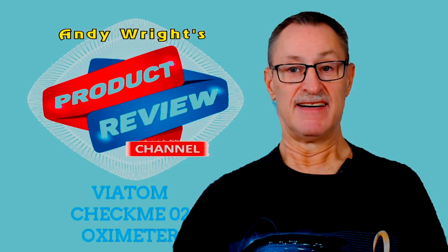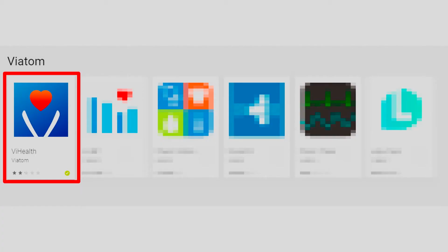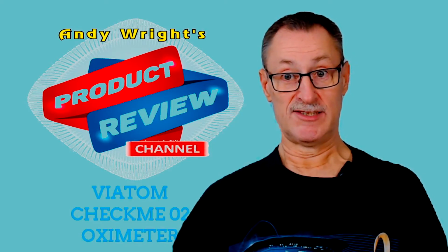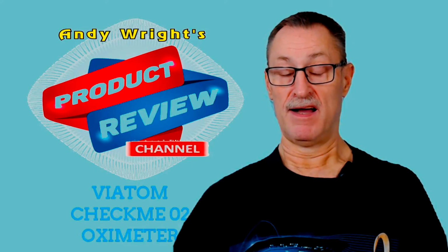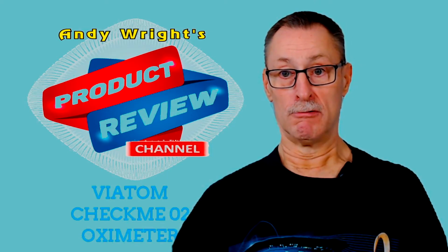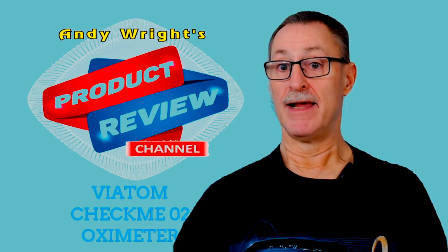Lastly, the app. Downloading the app. Yes, that was a right palaver. Now, make sure that you actually read the book, because it does say VI Health. I put in there V Health, and of course it came up with a whole load of apps which weren't right. So VI Health is mobile, is the app name. It does come up. It's a little blue icon on the Play Store. It works on Apple as well, iPhone, and also Android. There is a list of compatible devices in the book.